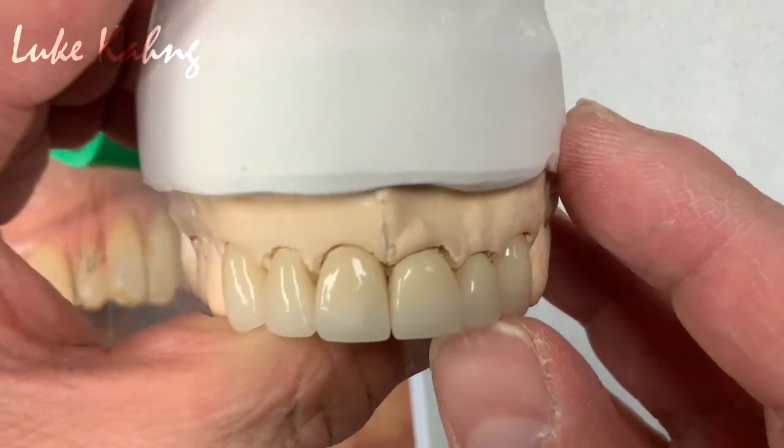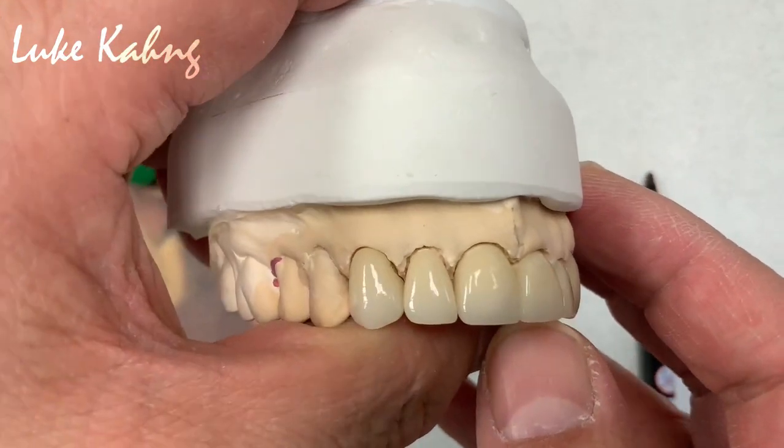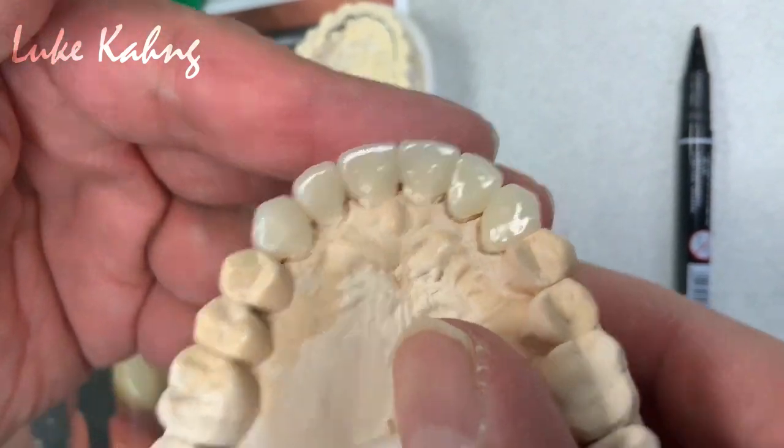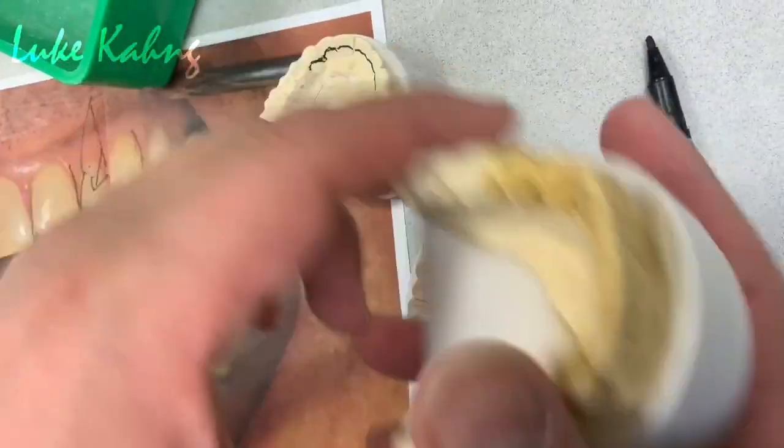Right? And then great color, shape, contour. This is cosmetic press, and here's his mounting.